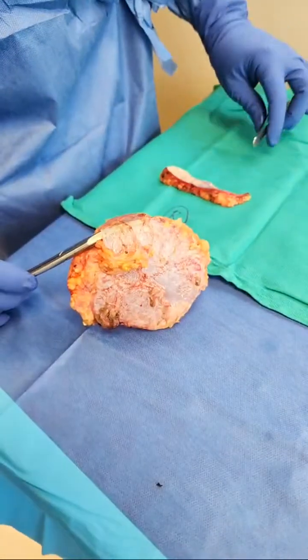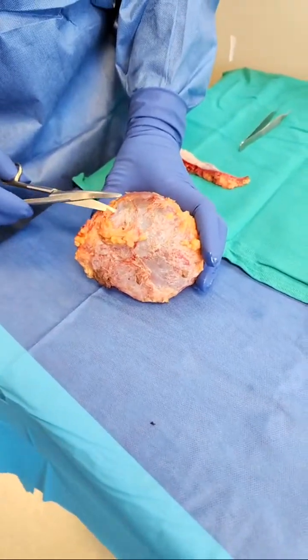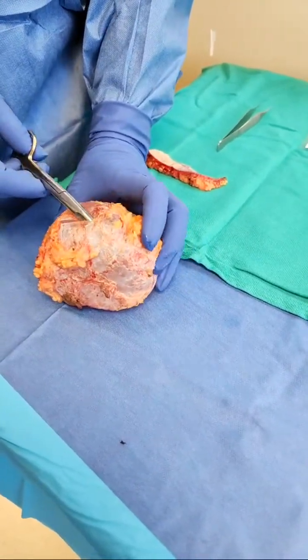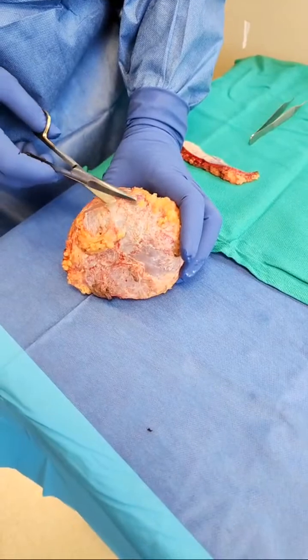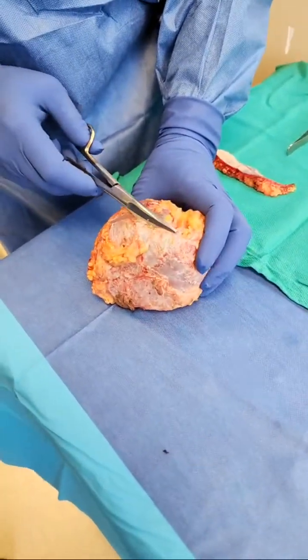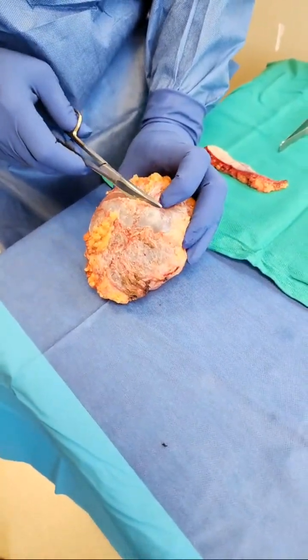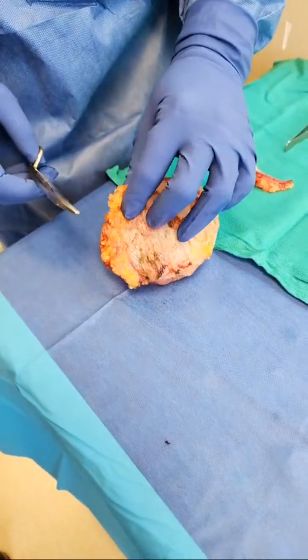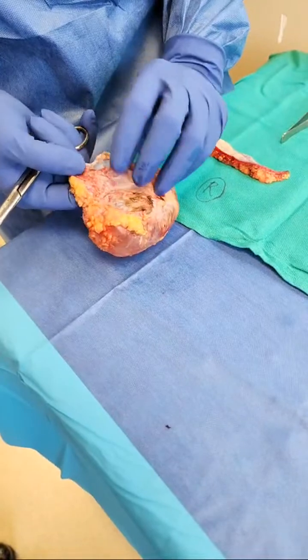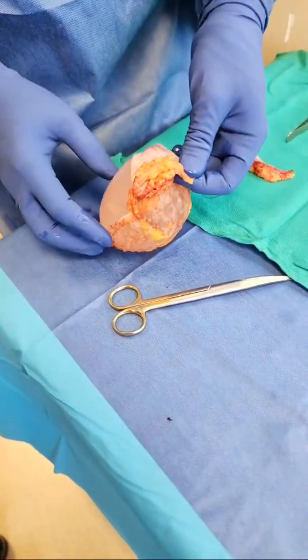So I've heard this from the many phone consultations that I've done. The surgeon said they could not remove the capsule because it was so thin. Now this is super thin. You can see, look at my instrument, right? No matter what, the capsule must be and can be and has to be removed. That's the whole essence of explant surgery. If you leave the capsule behind, you're leaving the burden behind. And so you can see, look how thin this is, right? And so the whole capsule needs to go, and look at the way the implant was sitting.